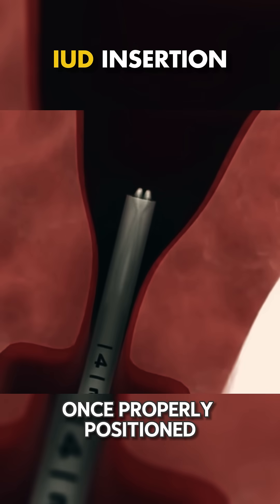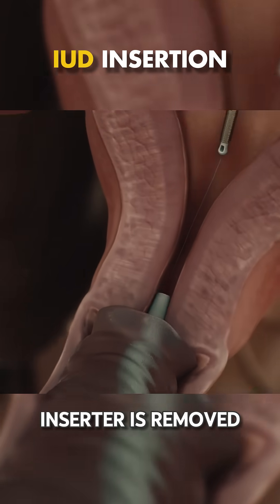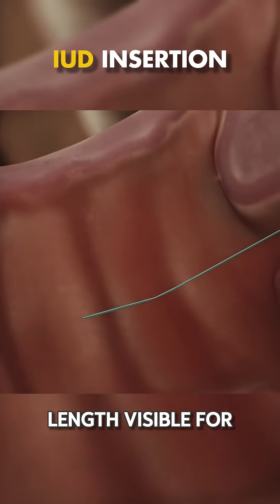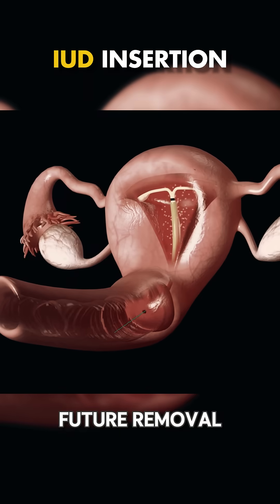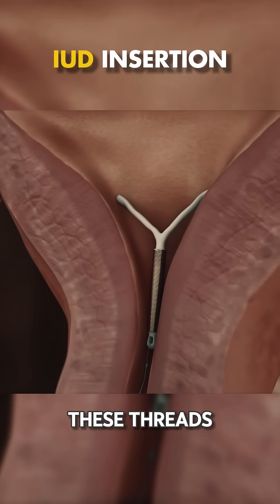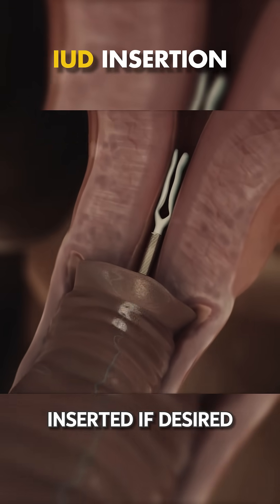Once properly positioned, the IUD is released and the inserter is removed. The doctor trims the IUD's threads, leaving a small length visible for future removal. When removal is needed, the doctor will simply pull on these threads using special tools, and a new IUD can be inserted if desired.